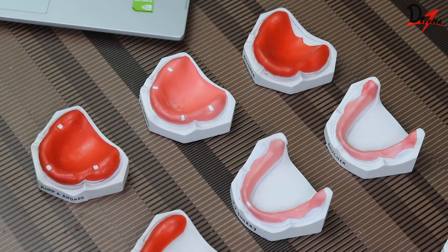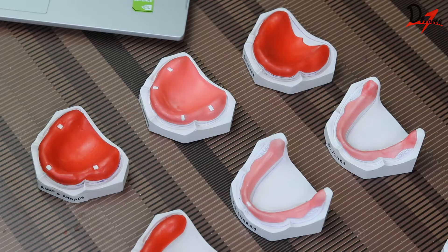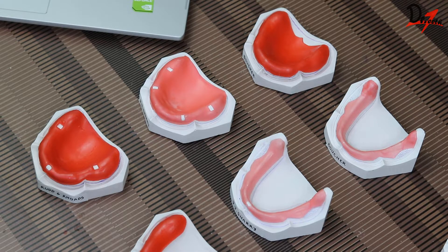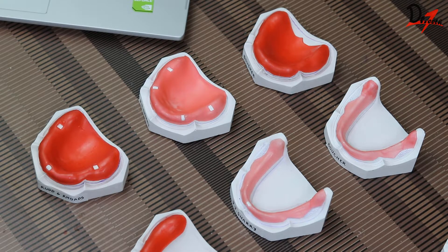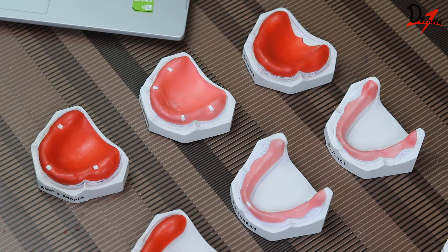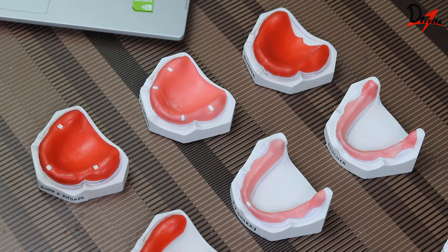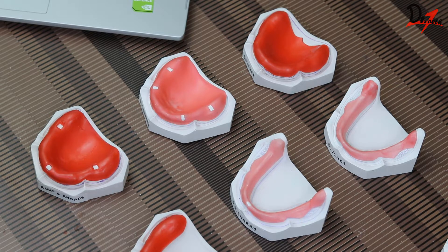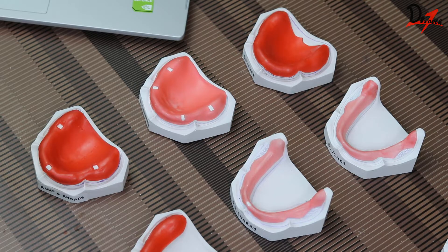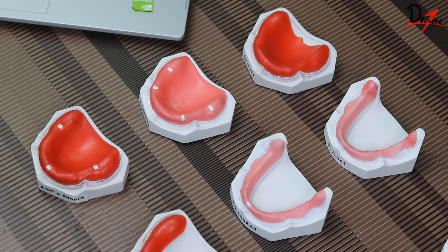Hello everyone, Assalamu Alaikum. I hope you are all doing fine. Today we are going to learn about different spacer designs given by different authors. I have a couple of casts on which I have made the different spacer designs, and we are going to learn about them one by one.